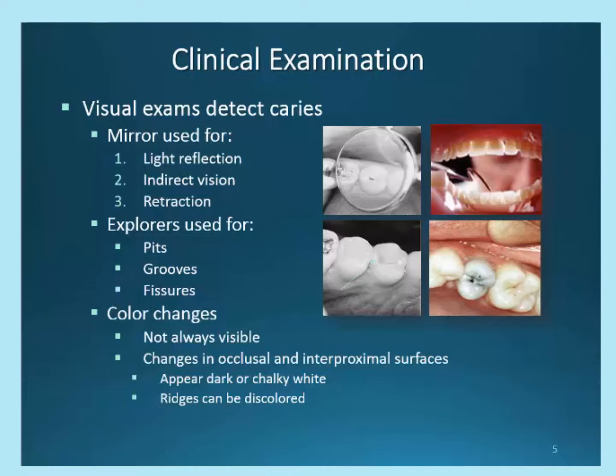You may have come across some difficulty in removing the instrument from the tooth surface if this pit was quite deep. Be mindful of this procedure, not necessary to actually do this if visible decay is obvious. Placing an Explorer into an open area of decay that is evident by sight may cause severe pain to your patient and further tooth damage.